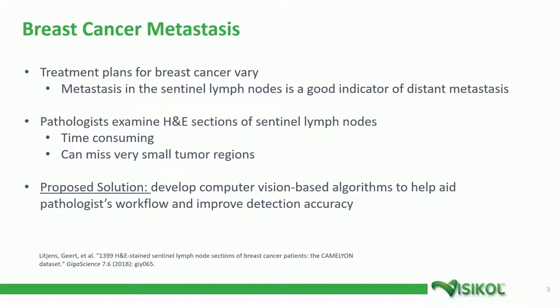While this method is very useful at determining metastasis, it can often be time-consuming and small tumor regions can often be overlooked by mistake. Therefore, the research community and Visikol has taken to working on novel approaches to aid pathologists using computer vision and deep learning.